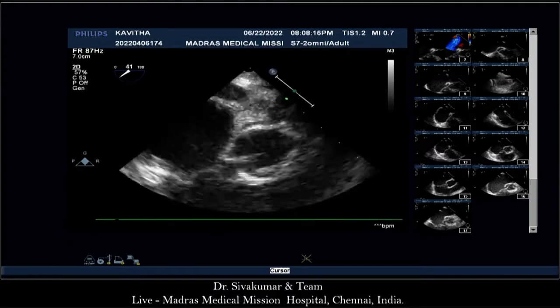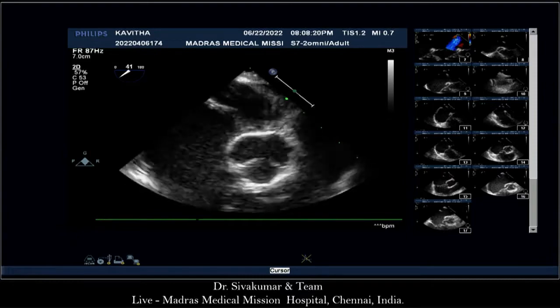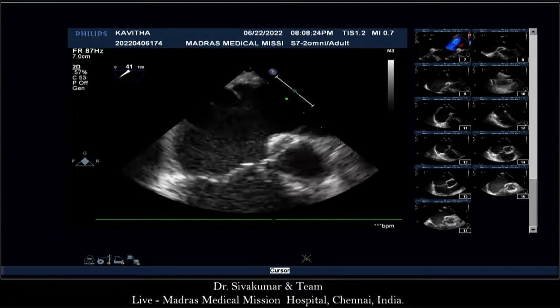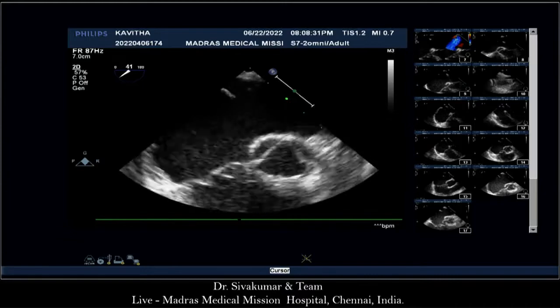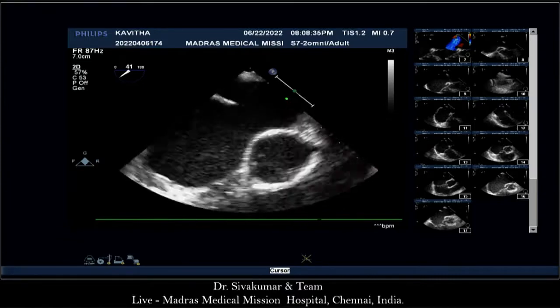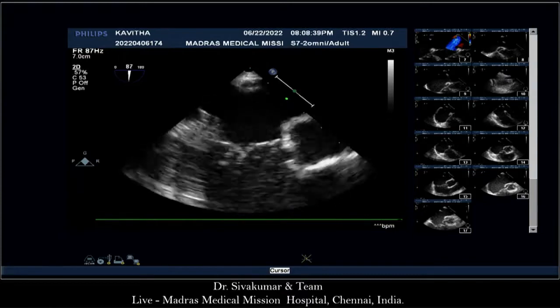See that it's actually going a little leftward. Okay, keep going inside, Srija. Yeah, I'm going in. Keep on going inside. Reform the septum. What is that? This is the actual plane. But when you pull it out, it is going leftward. Come to 90 degrees and show. Now you keep rotating rightward.